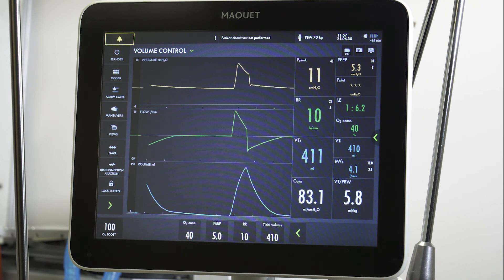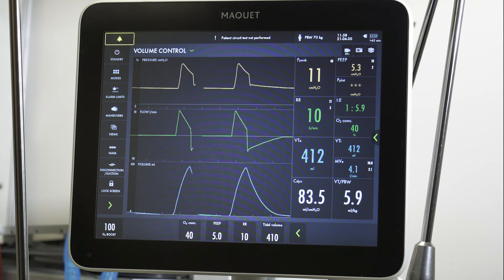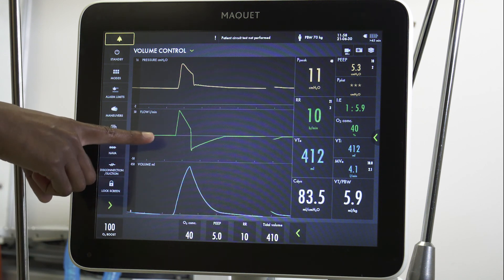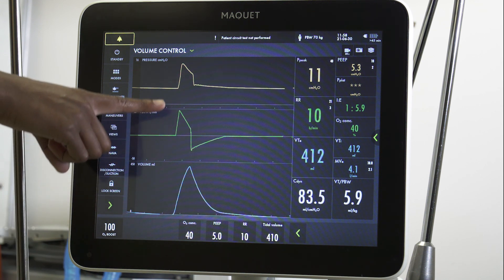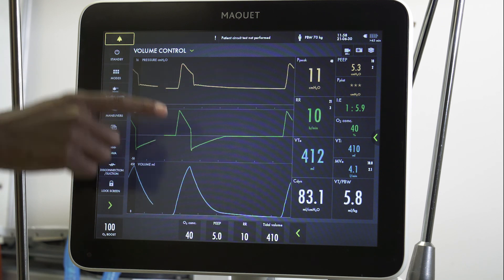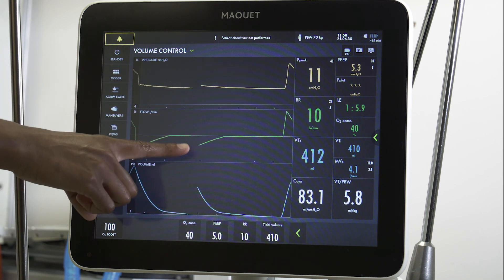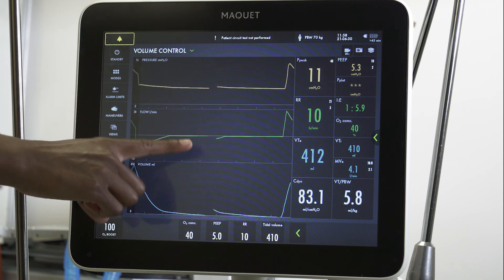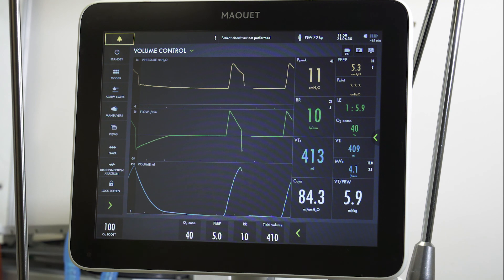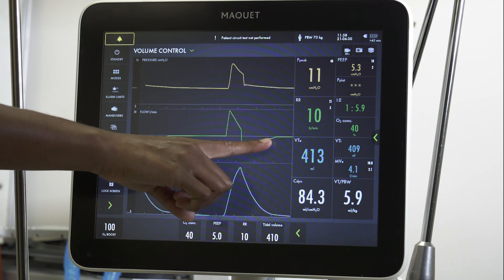One quick method of checking for auto PEEP is by looking at the expiratory flow graph here. All flow above the x-axis represents inspiratory flow into the patient, and everything below the x-axis represents expiratory flow out of the patient. You want to ensure that this line returns to zero before the next breath is initiated.